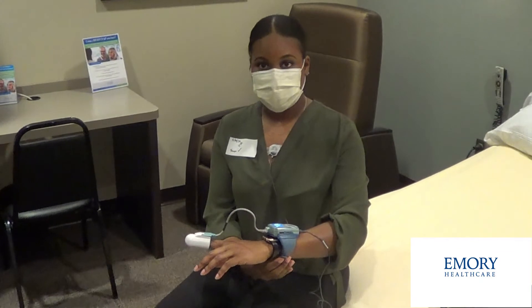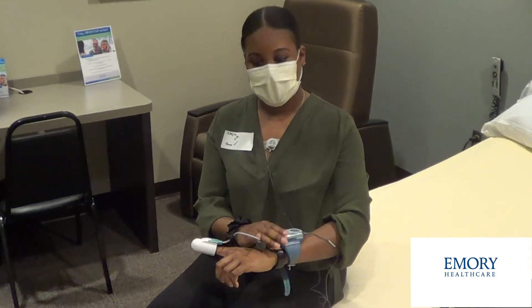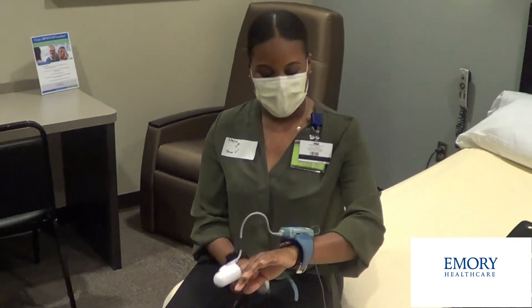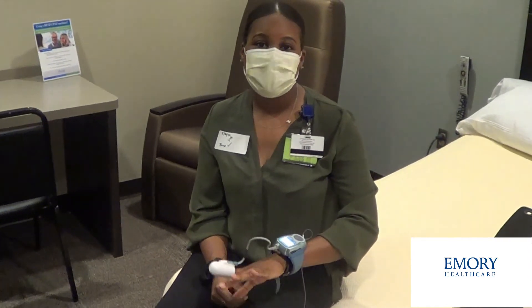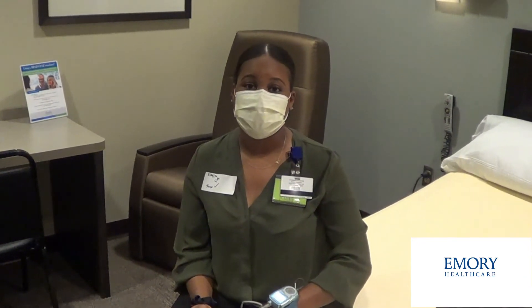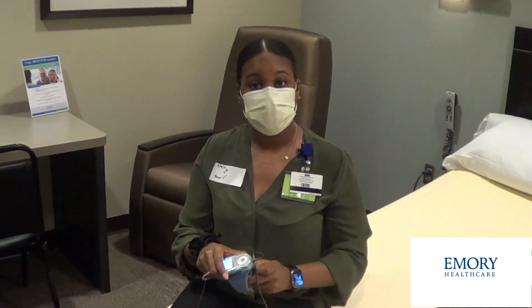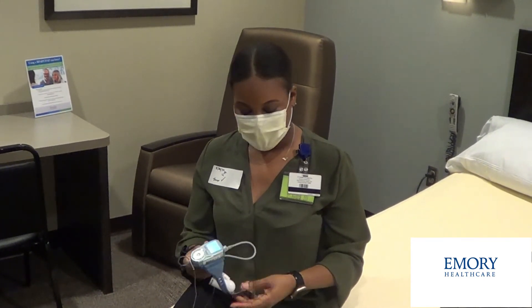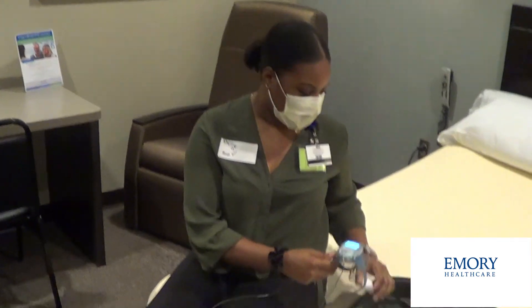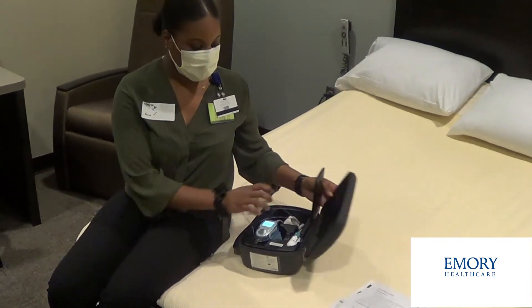Once everything is finished, it should look similar to this: the sensor on your chest, device on your non-dominant hand, and probe on your non-dominant hand. If you have to get up throughout the night to use the restroom, that's okay — just take everything with you. Don't take anything off until you're ready to wake up for the day. When you do, just take everything off. Don't turn the device off — it'll time itself out once it stops sensing your pulse. Return everything to the box as you received it the following morning and bring it back.